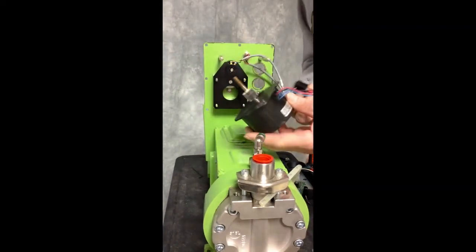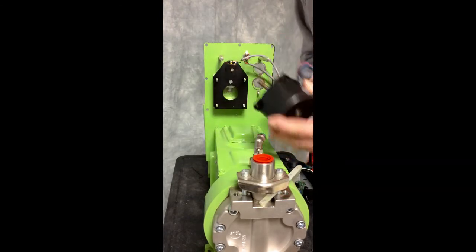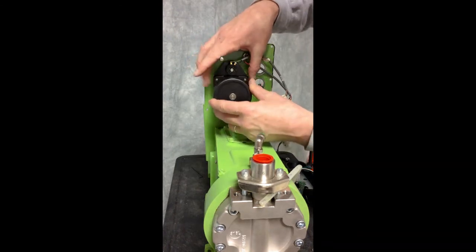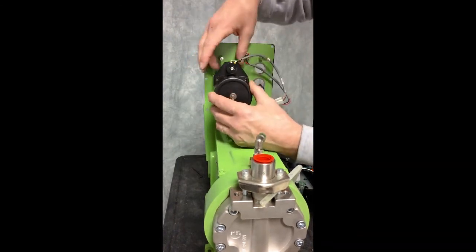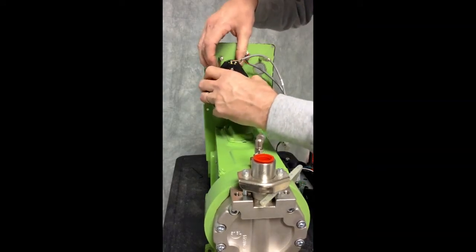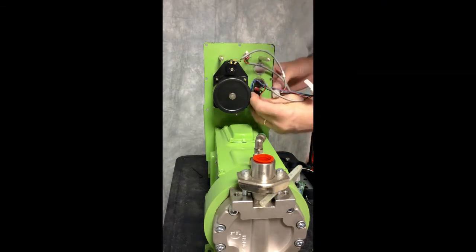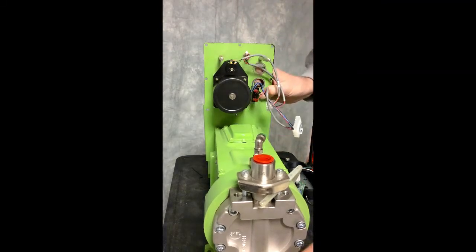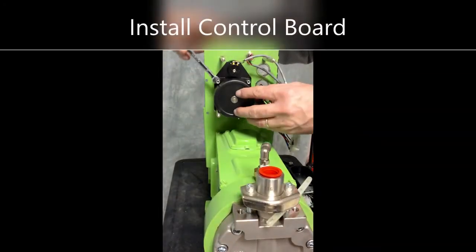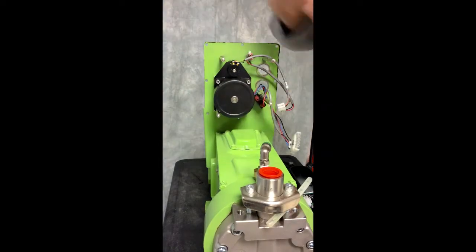You are now ready to reassemble the ELMA, putting the new motor and capacitor onto the pump. Place this in position, watch for the gearing and the capacitor, and secure.